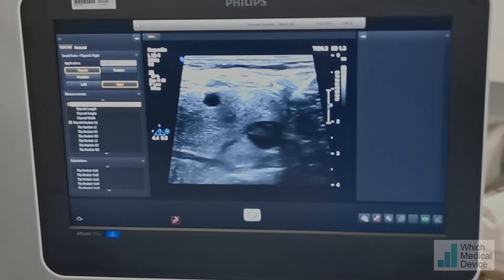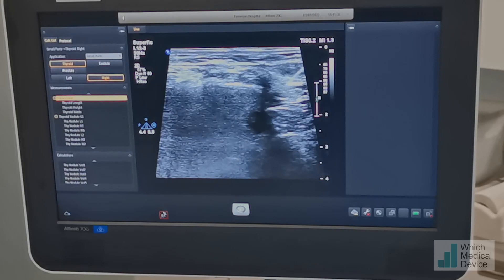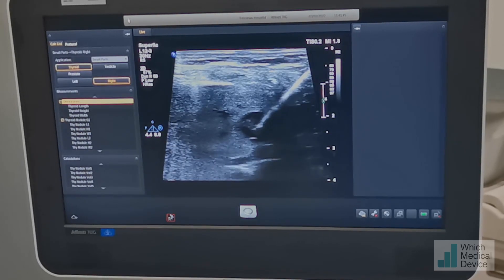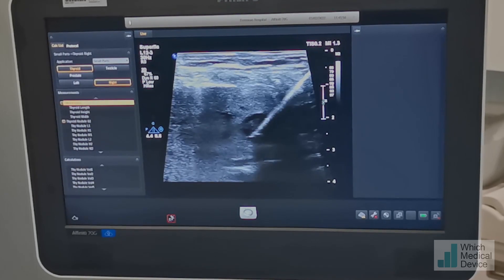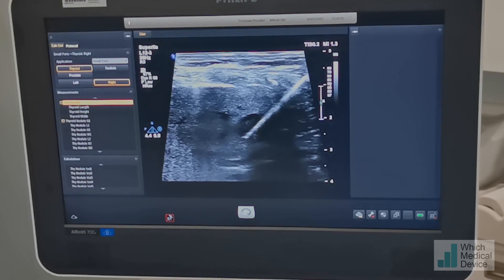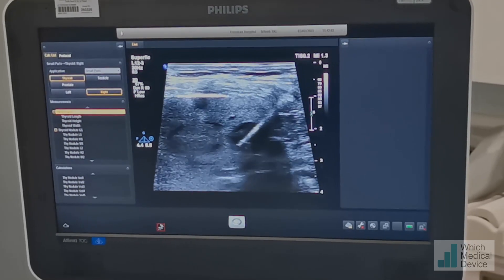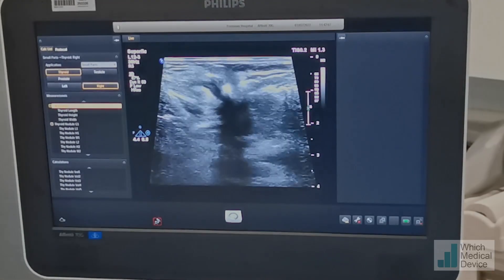Transplant kidneys are always very scarred. That looks very good — it looks like you're right in the middle of it. Take it to the far side, just to the back. That's perfect. Hold it there — I would stay just there. Now look transversely as well. Turn your probe around and we'll just get a view in a different direction to check we're right in the middle of it.